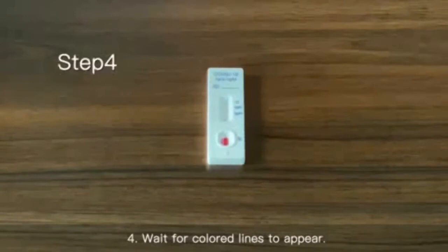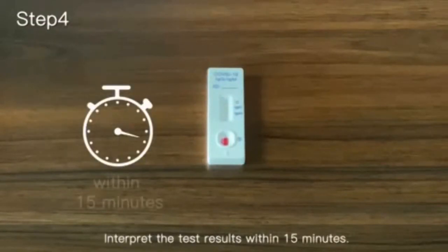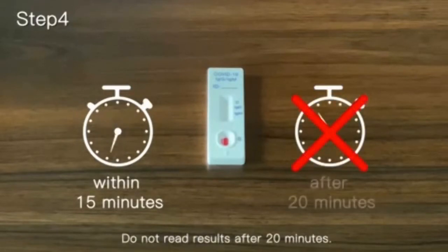Step 4: Wait for colored lines to appear. Interpret the test results within 15 minutes. Do not read results after 20 minutes.